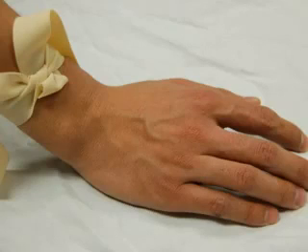The position of the patient during insertion depends on the site where the IV is to be placed. Here we demonstrate an intravenous catheter placement in the dorsum of the hand. Drape the patient's arm over the side of the bed to increase the venous blood in the extremity and help you to identify a suitable vein.